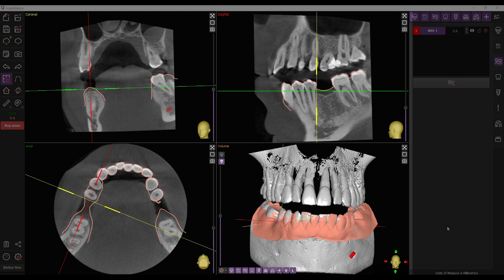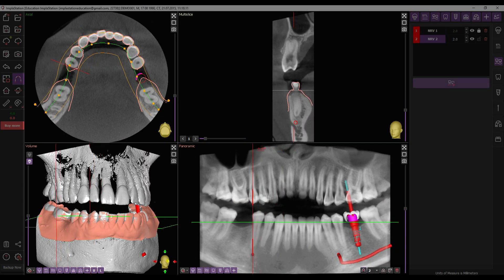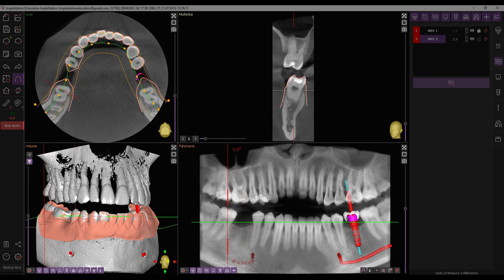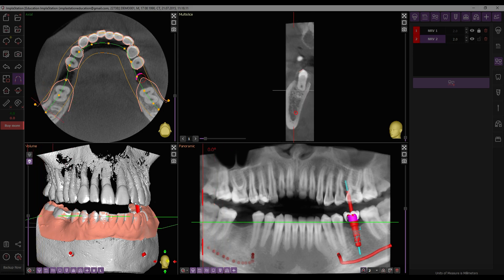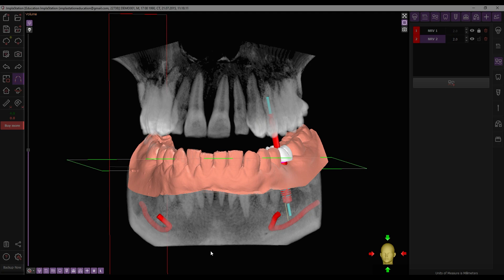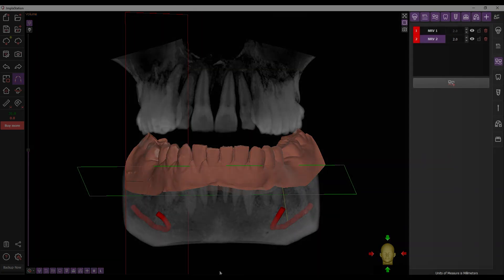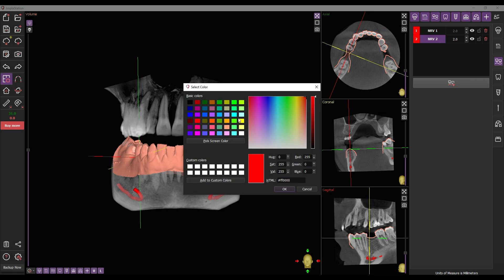You can also trace the nerve in pano mode. Find the mental foramen and draw the mandibular canal in the multi-slice window. Manage the created canal in the list on the work panel.